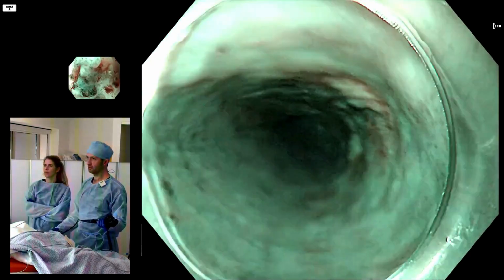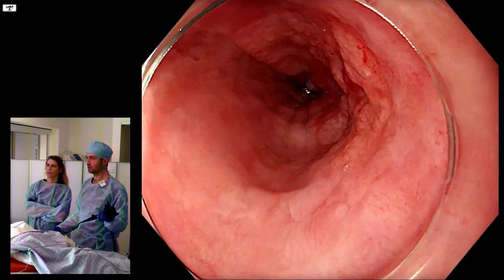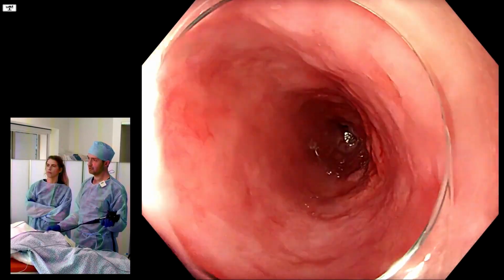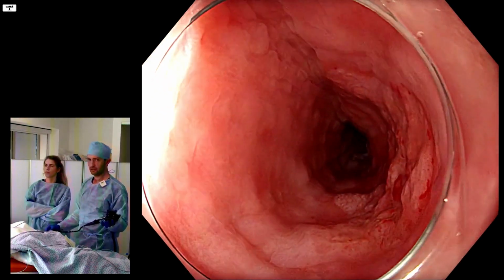And then, of course, we can talk probably all day about the pros and cons of endoscopic resection of this lesion, but here we will endoscopically resect this and send it for histopathology. All right, so thanks very much for watching.